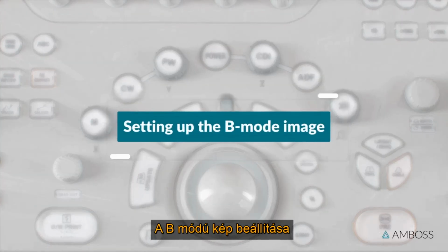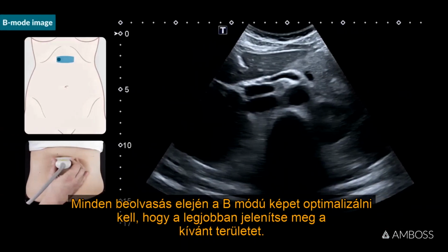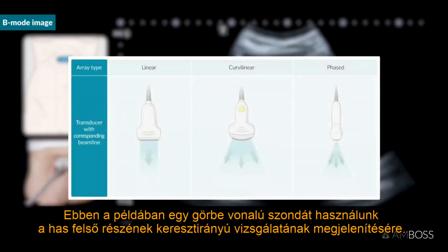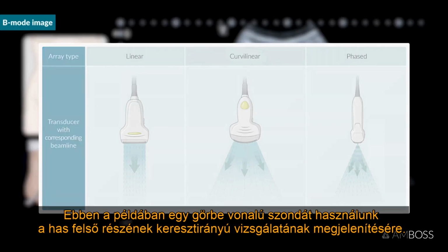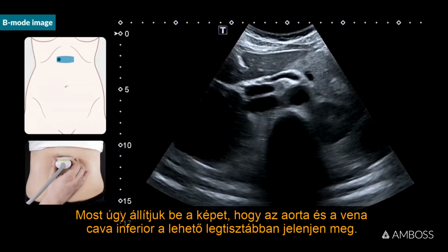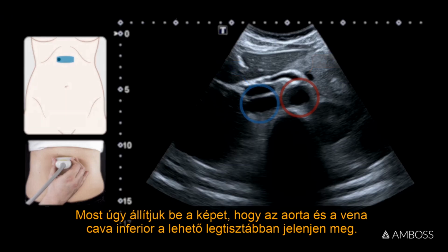Setting up the B-mode image. At the start of every scan, the B-mode image should be optimized to best display the area of interest. In this example, we're using a curvilinear probe to show a transverse scan of the upper abdomen. We'll now adjust the image to show the aorta and inferior vena cava as clearly as possible.